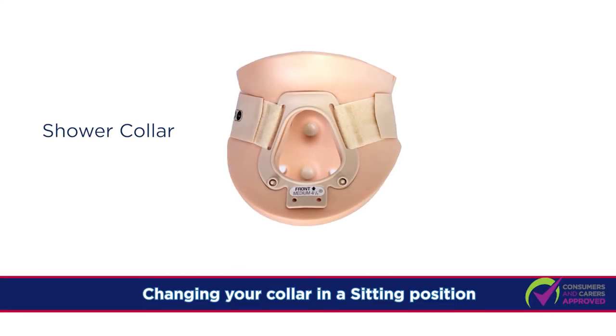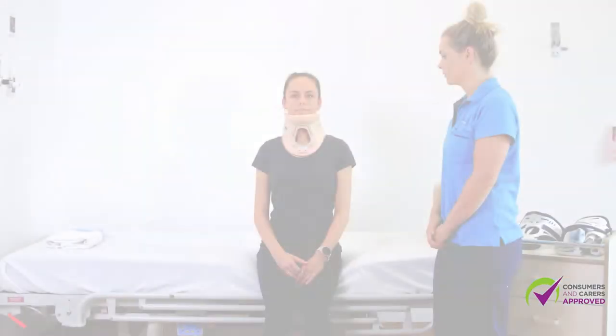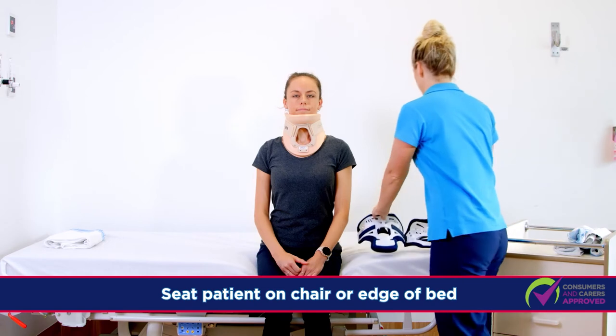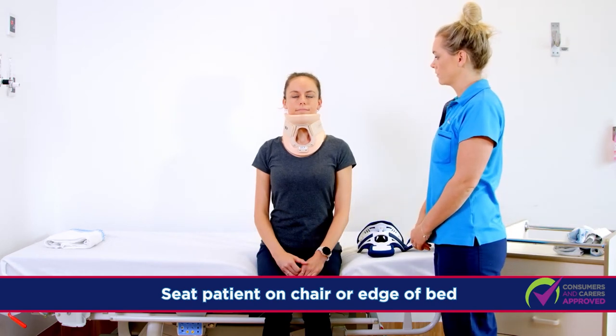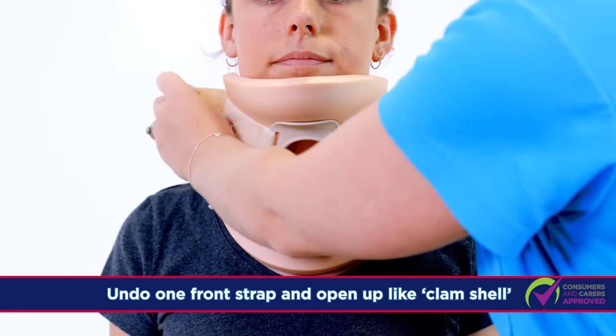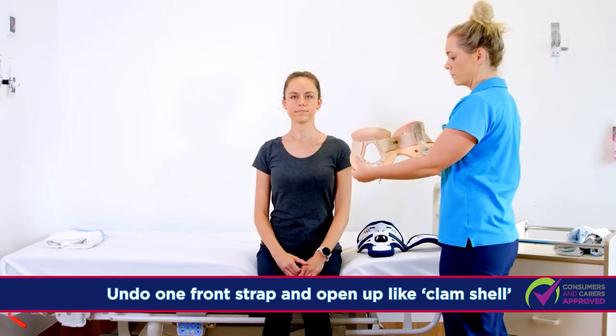We will now show you how to change from a shower collar into the Miami J collar. Have the patient sit in a chair or on the edge of the bed. Tell the patient to sit still and not move their head at all times. Undo only one of the Velcro straps of the shower collar front piece to open up like a clamshell and remove the collar completely.